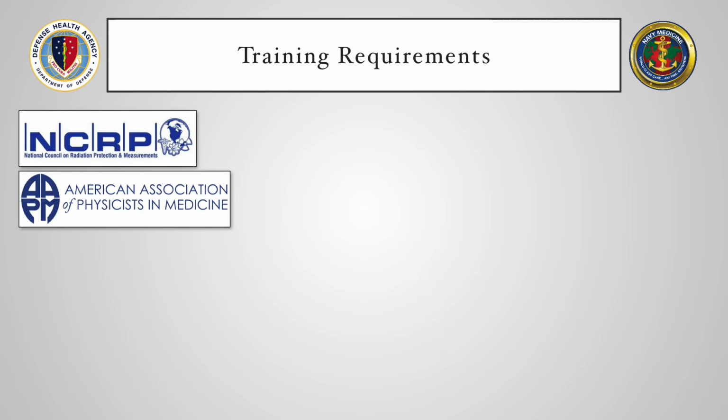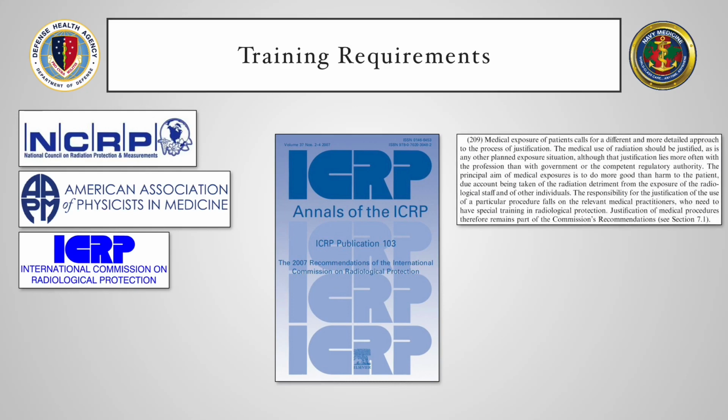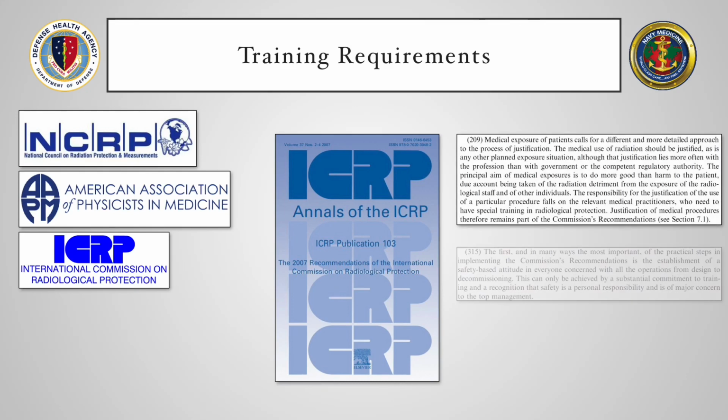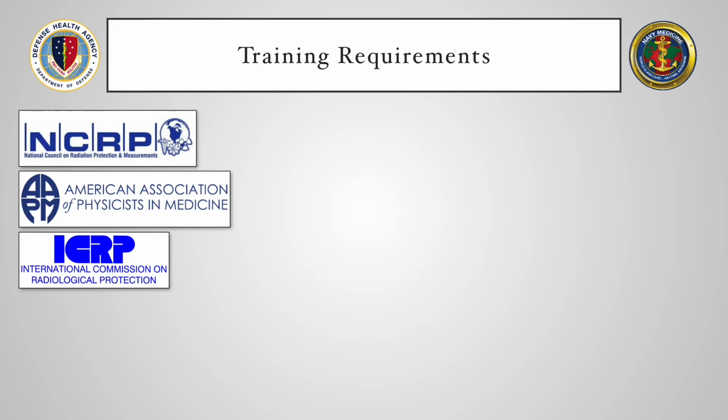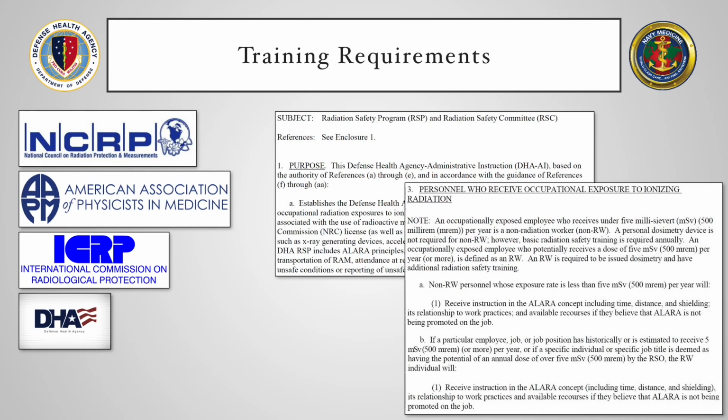The 2007 recommendations of the International Commission on Radiological Protection state that medical practitioners need to have specific training in radiologic protection that's specific to each modality of ionizing radiation. The Defense Health Agency requires both radiation workers and non-radiation workers to go over the ALARA concept, which includes time, distance, and shielding.